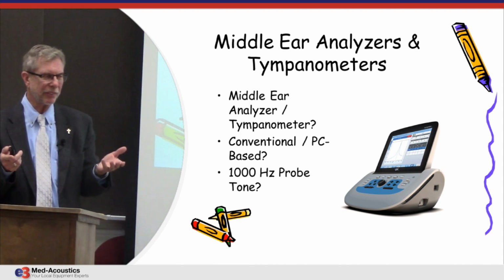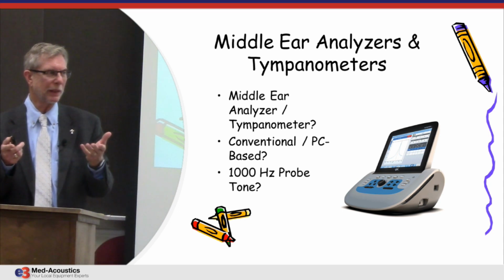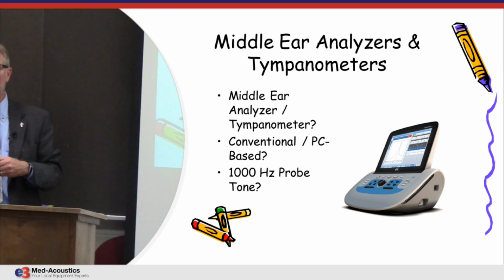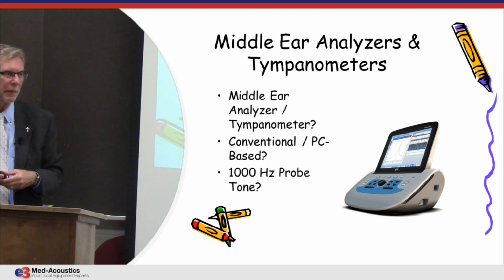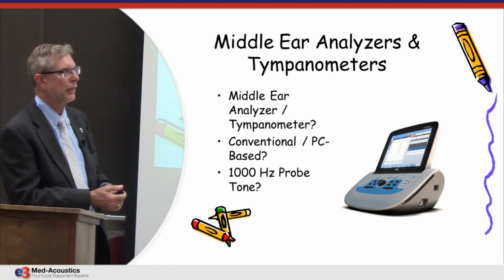Tympanometer, classically, refers to more of a screener, where a middle ear analyzer is more diagnostic. And do you want one that is conventional or PC-based? The PC-based is rare. Most of them are actually hybrids, like this. This is a TympStar Pro. It replaced the old TympStars.